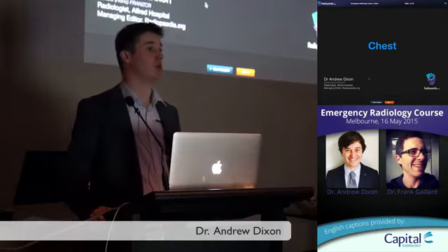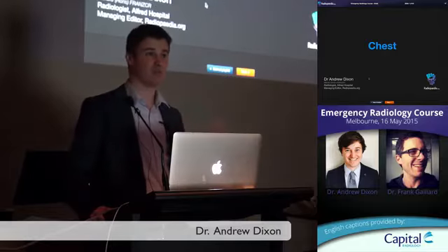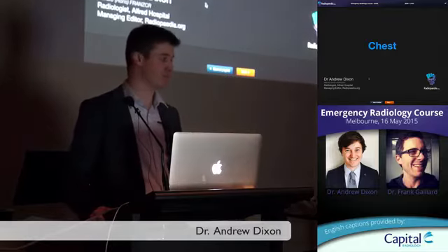Okay, welcome back. We're moving on to the chest and then the abdomen session. It's going to be a little bit more heavy on CT imaging, but still with the chest we do a fair bit of plain films.